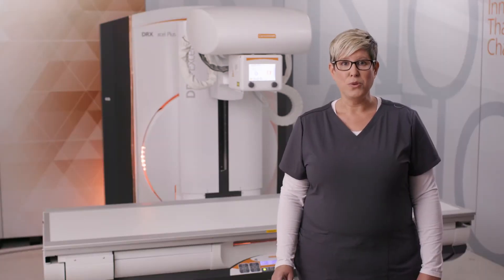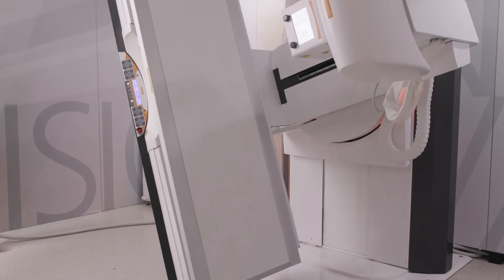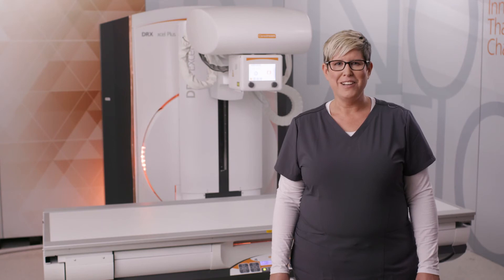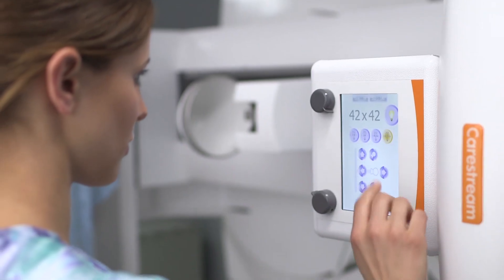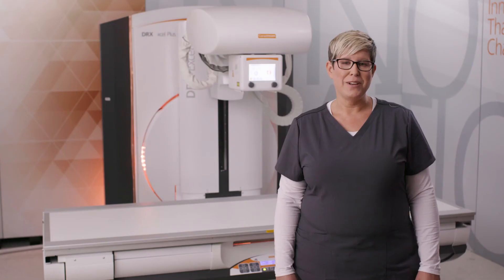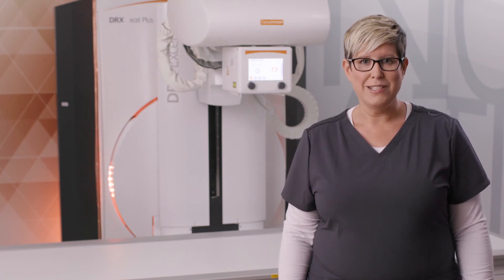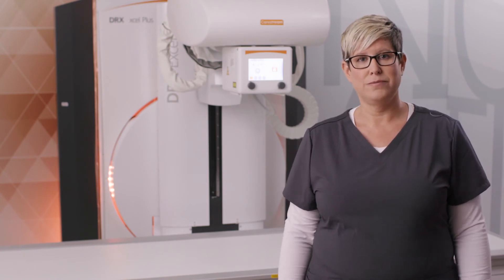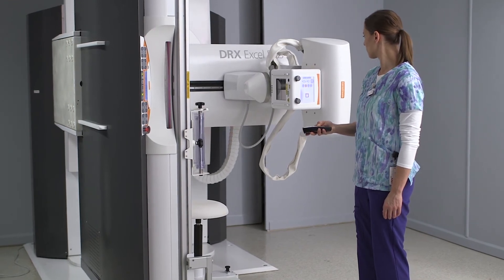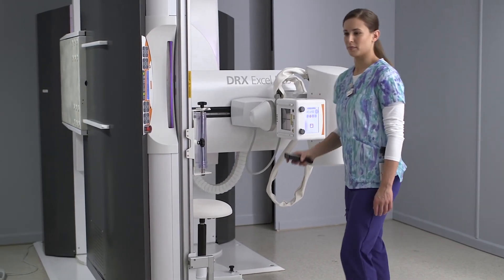Automatic tracking between the tube and the detector ensures there is always perfect alignment. The touchscreen collimator is another work zone for the technologist, allowing for all movements of the table as well as the control of generator parameters. A camera integrated into the collimator helps to monitor the patient and aid in positioning without the use of radiation from the control console. Additionally, an optional handheld remote gives access to table movements from anywhere in the room.